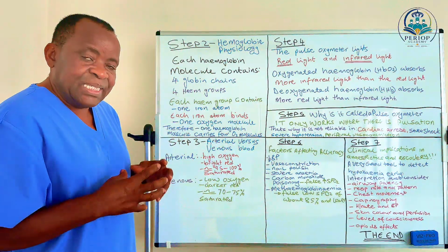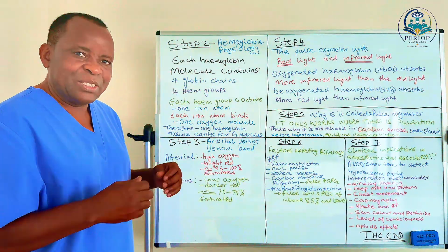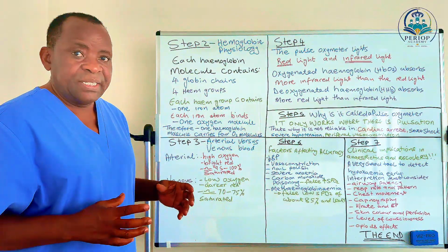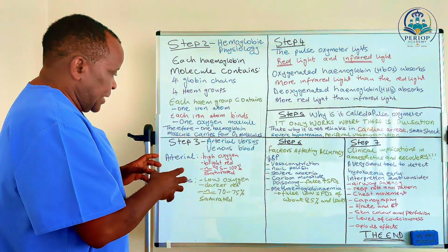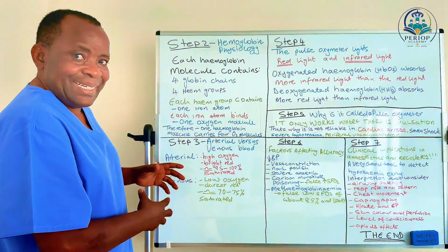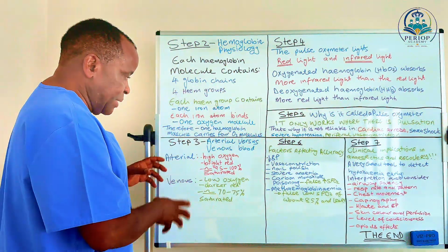However, because this is kind of mixed blood, the deoxygenated blood is not totally devoid of a bit of oxygen. It is there, but it is not compatible with life. So we want to see this scenario, these 2 types of blood presentation and how it relates to pulse oximetry.